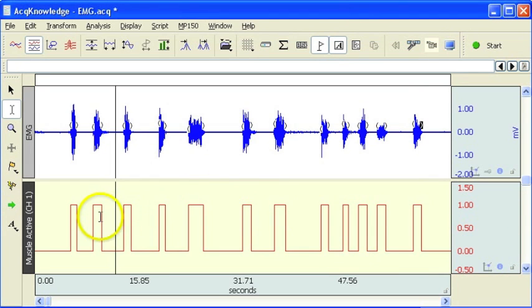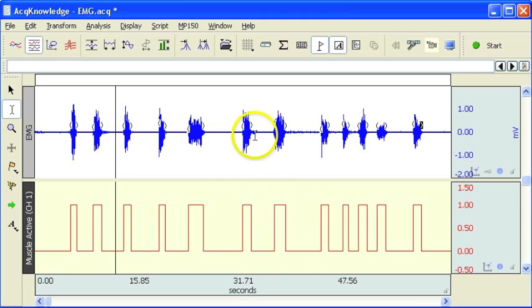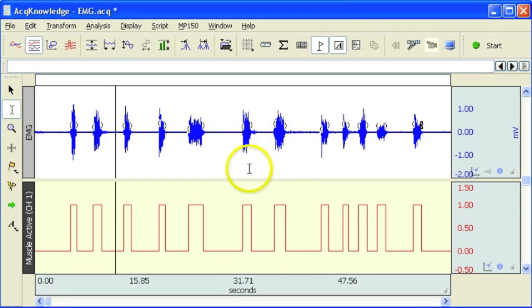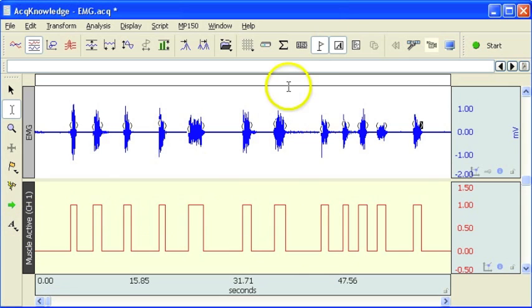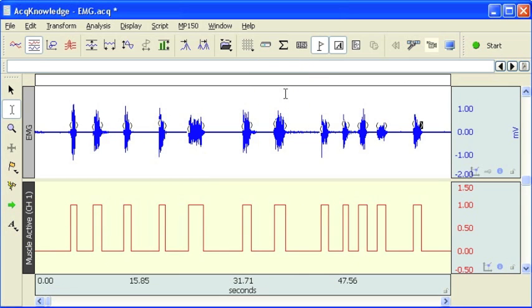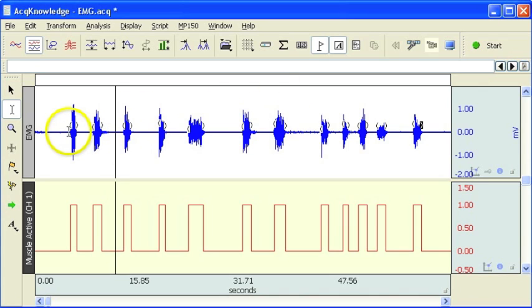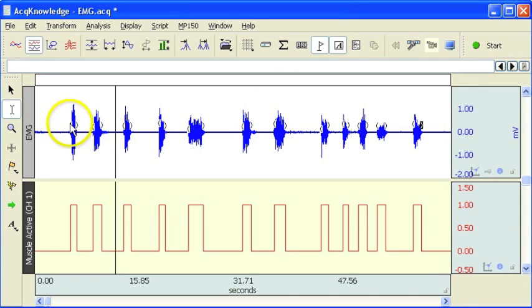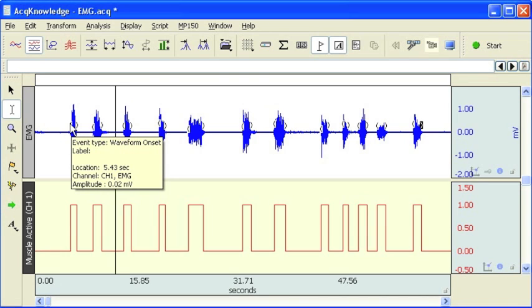And there we go. Now by increasing that threshold a little bit where it was double triggering before, we've got rid of that. So now we have a nice digital representation of when the muscle activity occurred. And you'll notice on the raw waveform, the software has also put these event marks in. This is event type waveform onset and it gives you a little bit of information about that.